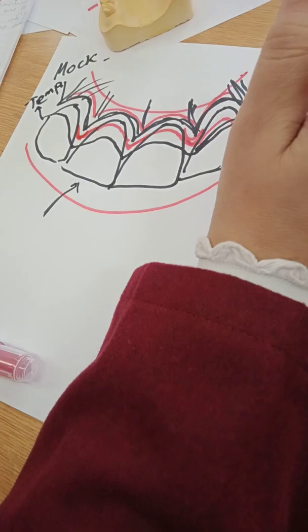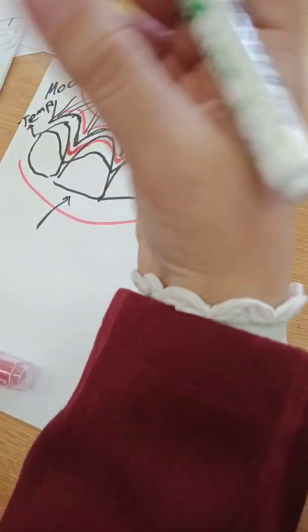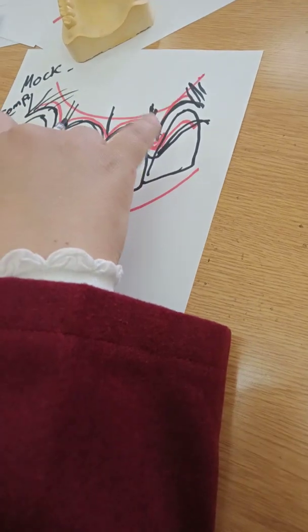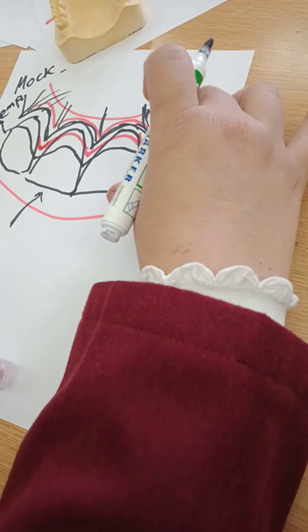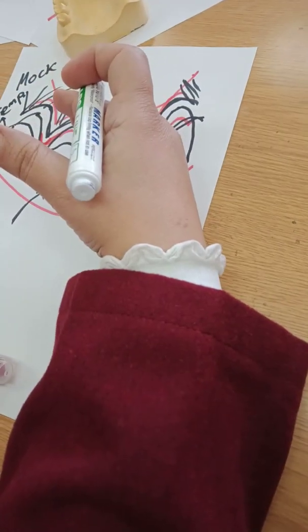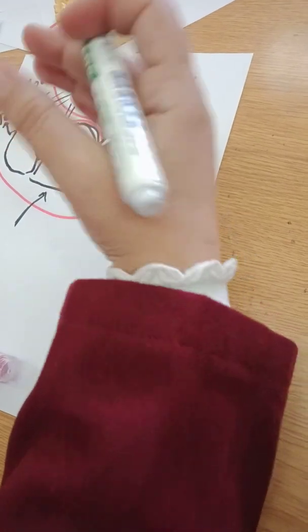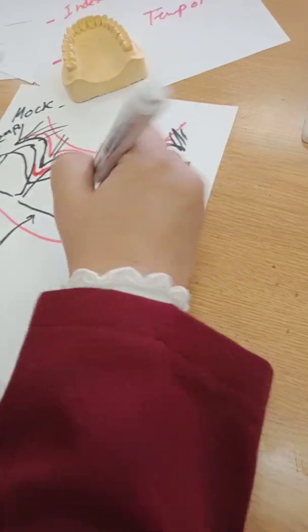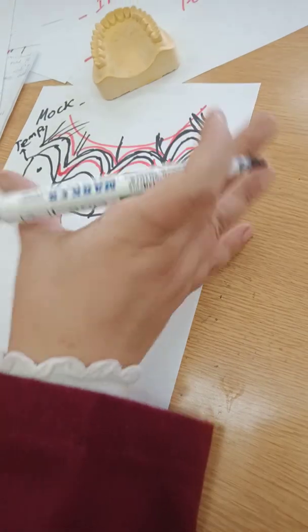I don't need to have wash and putty here. One material is enough. And why do I need it? Because I want to make it temporary. How is the temporary made? By flowable composite or some composite, but not the weak temporary mock-up material. You have to have composite, actually. Now, the tooth should be isolated because I don't want it to stick there, unless I want it to stick, as I need it for temporization. If I want it to stick, I do pinpoint acid etch and bonding, and I flow my material. It's a flowable material.